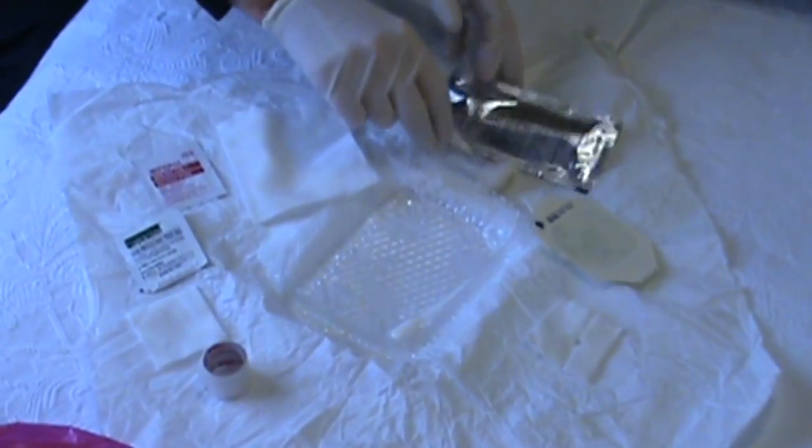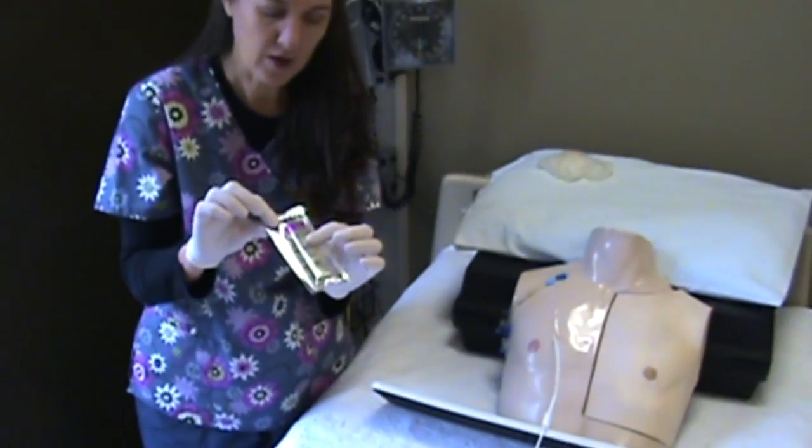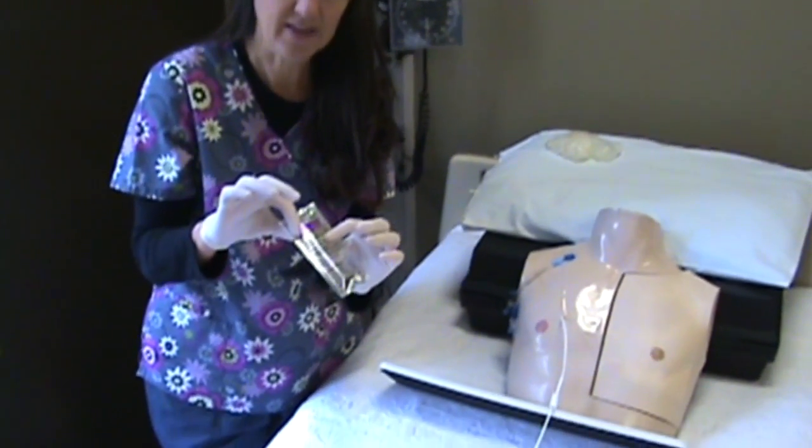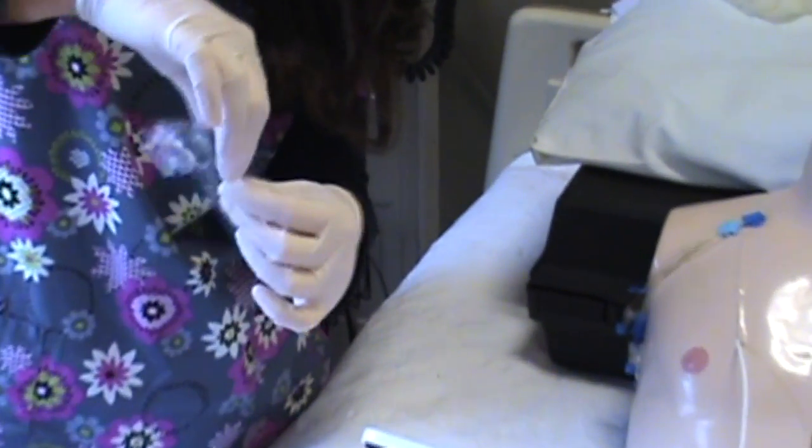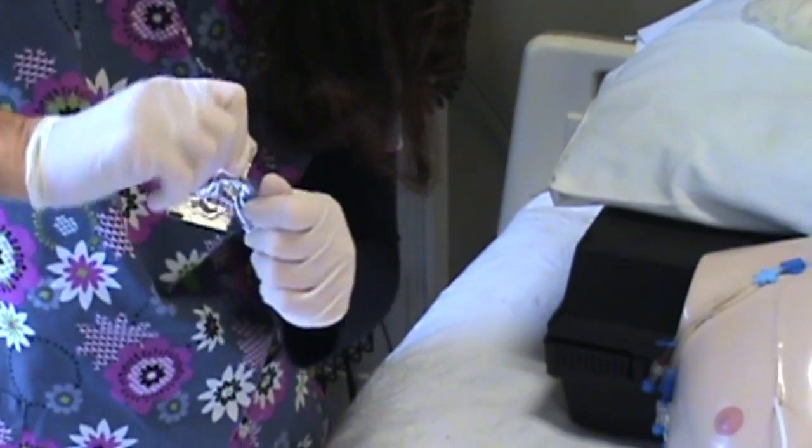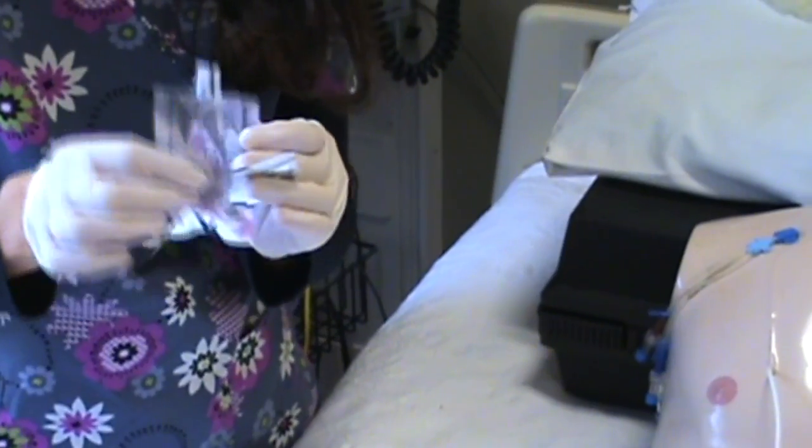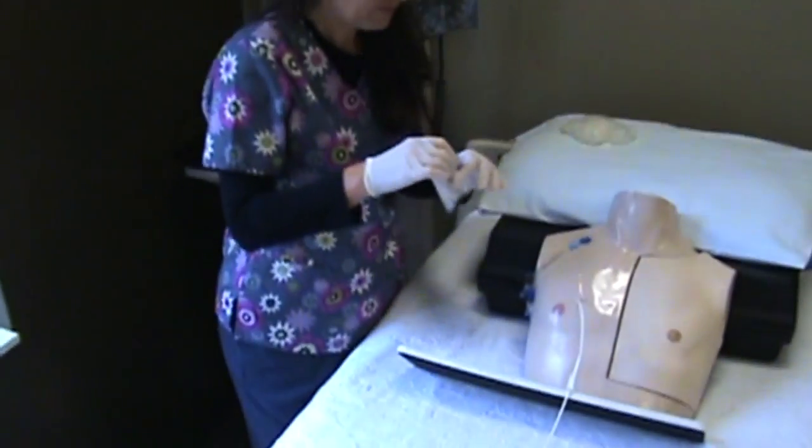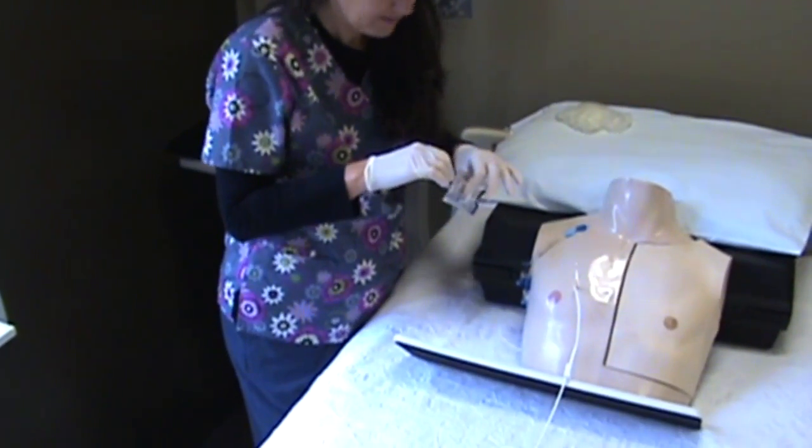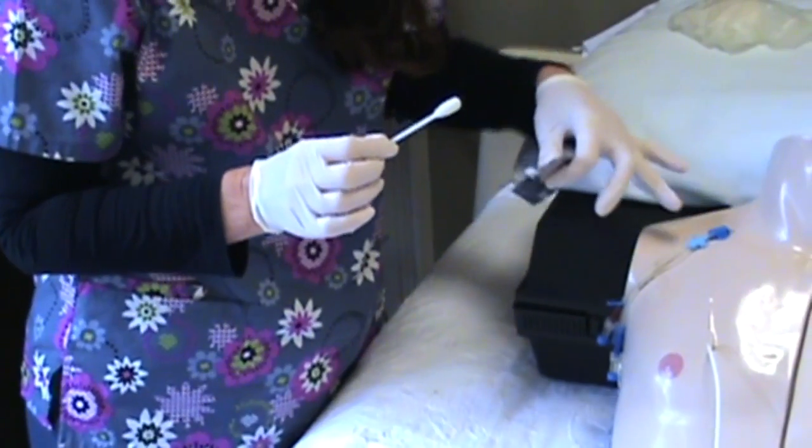Now let me show you this. These are your alcohol swab sticks. If you have something like this in your kit, just take it and open it on one side and then go to the other and open that and twist it. Then you'll have a little extra alcohol in here, so you'll pour out the excess.